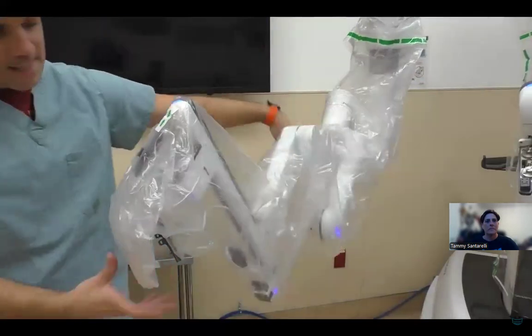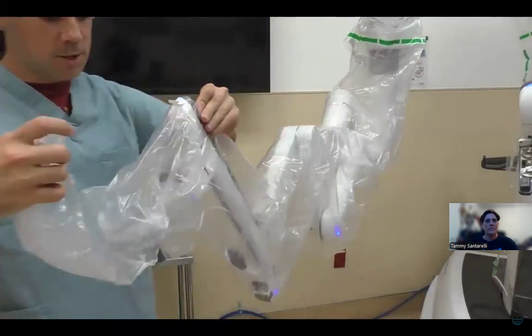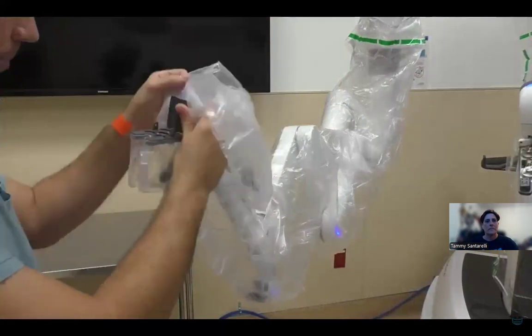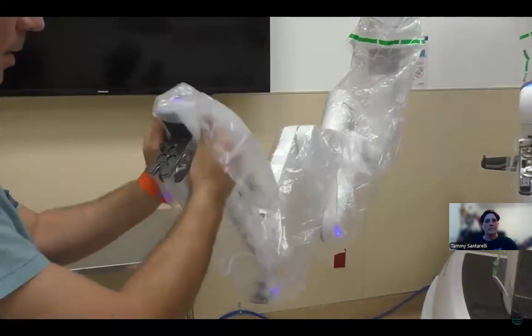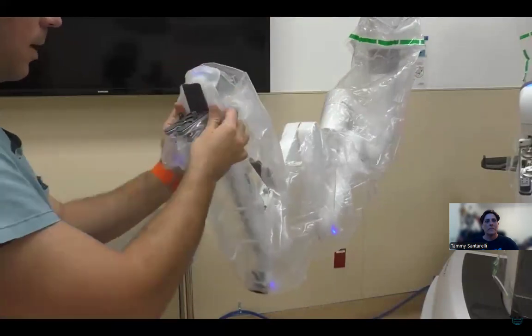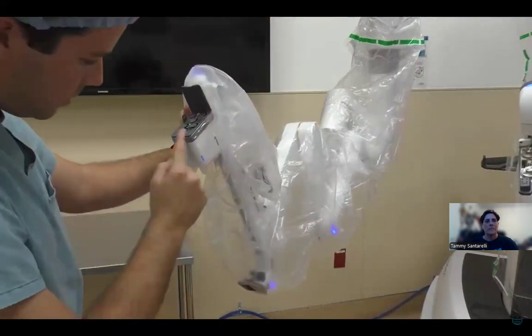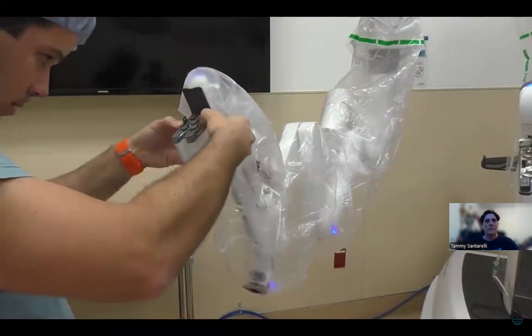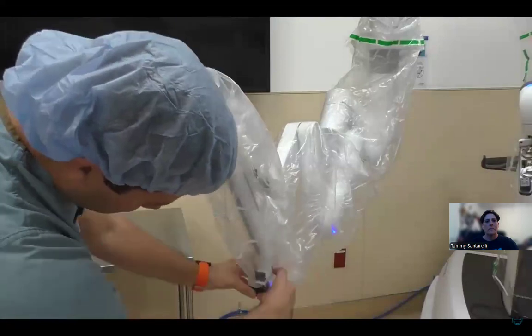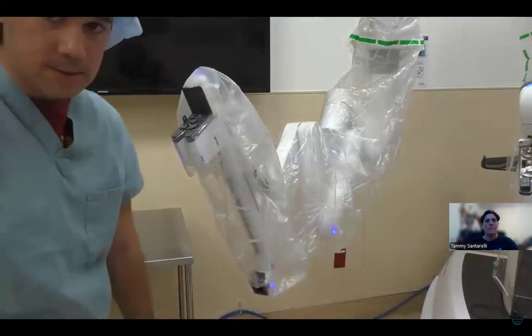Kind of pull some of the slack out. We're going to undo this tape, bring this down a little bit. Now we will attach our top plastic piece and our bottom plastic piece.